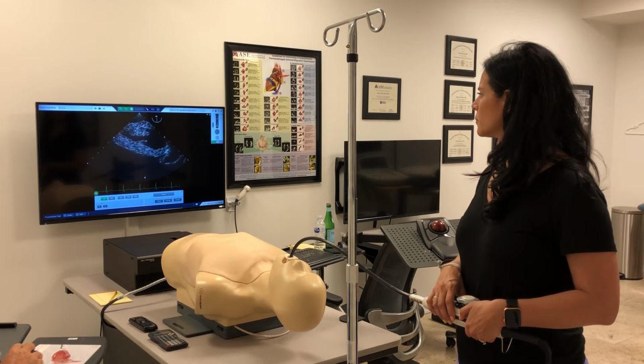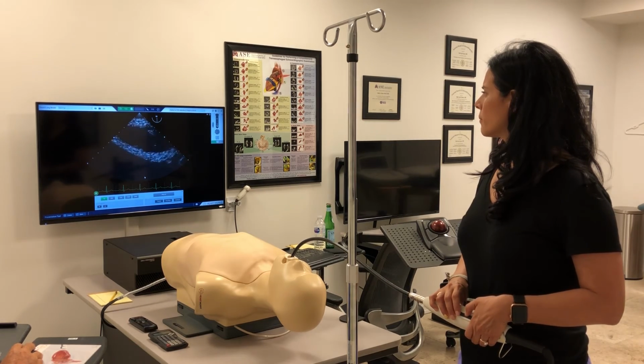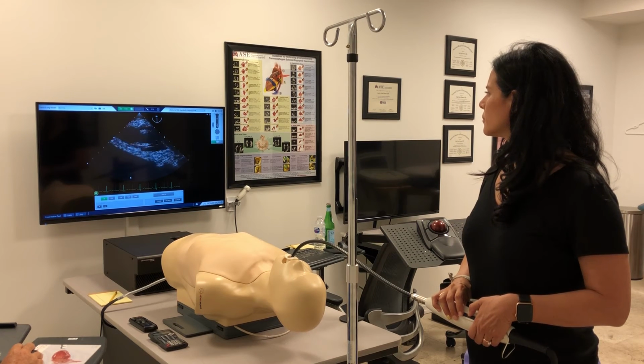You might want to just tweak the rotation a little bit to light up those chordae. Here they come. There they are. Very nice. You can see both the primary chordae going to the tips and the secondary going to the underbody of the mitral valve leaflets.